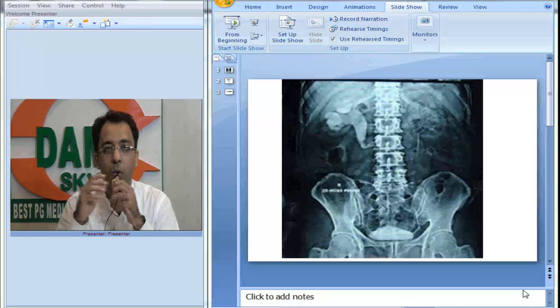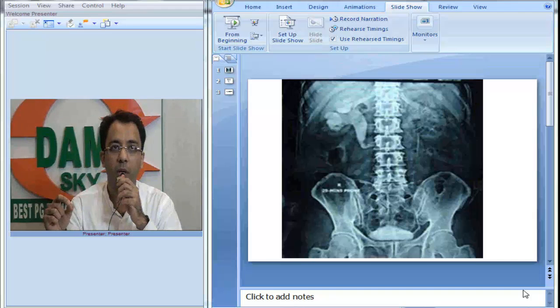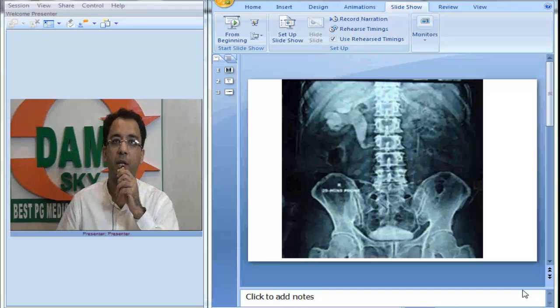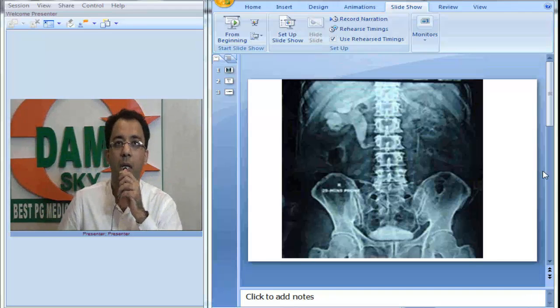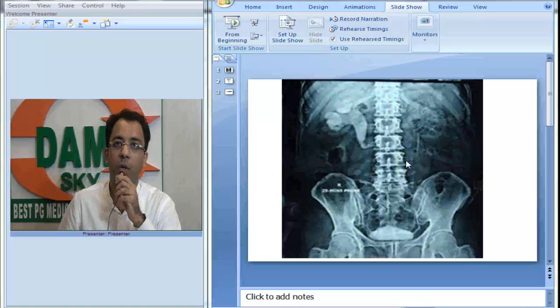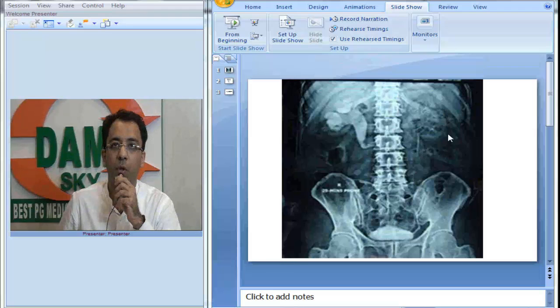Hello everybody, today I will discuss an interesting intravenous pyelography IVP image showing a very classical finding. Let us see this IVP image in front of you. What do you appreciate if we take a careful look?